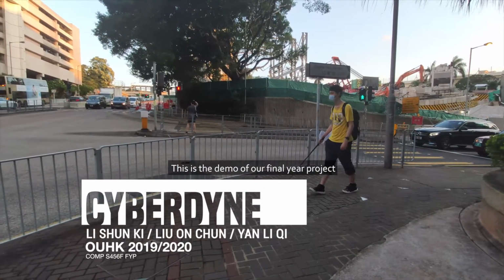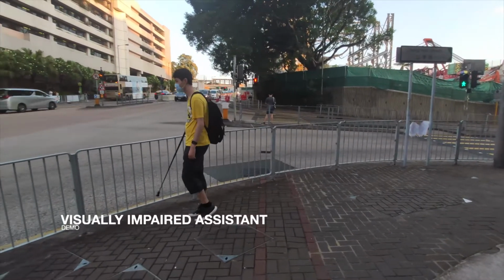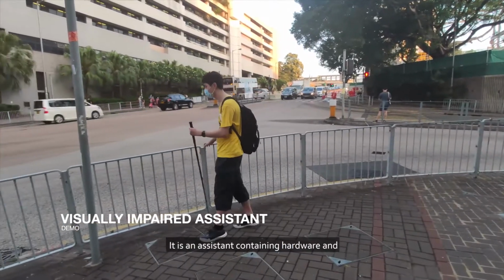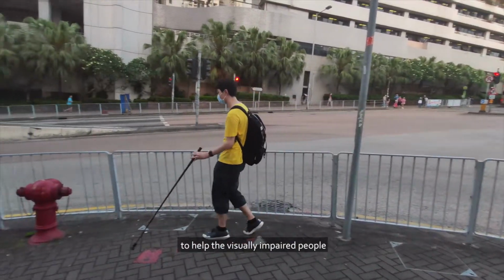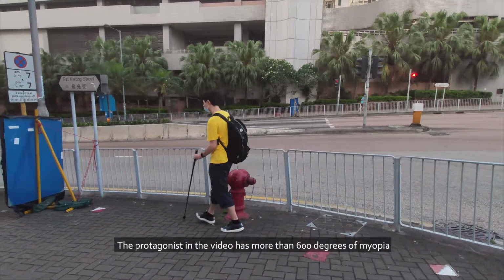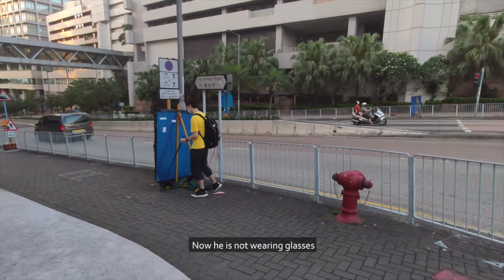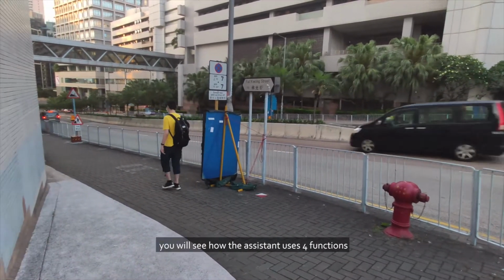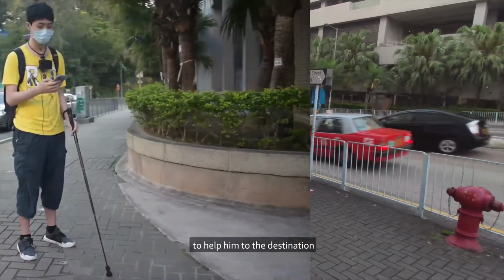This is a demo of our final year project, the Visually Impaired Assistant. It is an assistant containing hardware and an Android app to help visually impaired people who speak Cantonese to go out. The protagonist in the video has more than 600 degrees of myopia. Now he is not wearing glasses. You will see how the assistant uses 4 functions to help him to the destination.